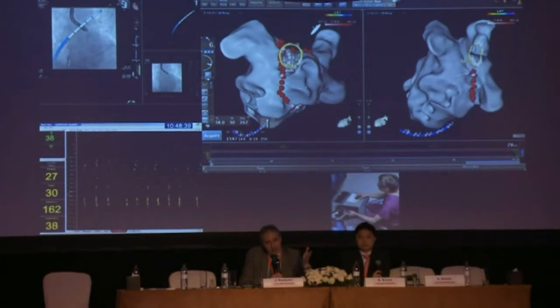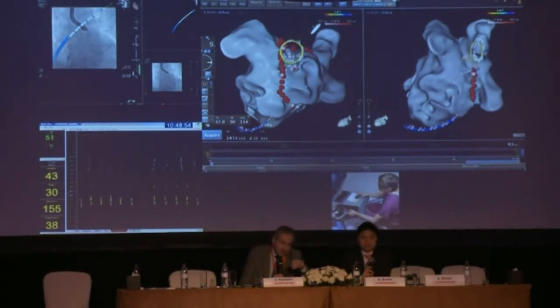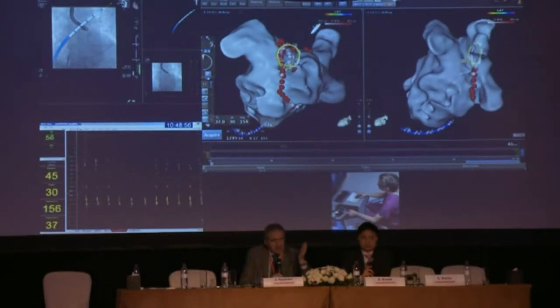You can alternatively also use intracardiac echo to see exactly where you are. With what we use in our setup, Smart Touch is very good because it tells you really that you are pressing to the carina from that side or from that side. So, yeah. But you cannot use it with the Hansen, right?